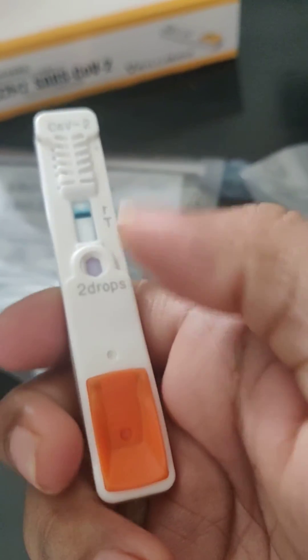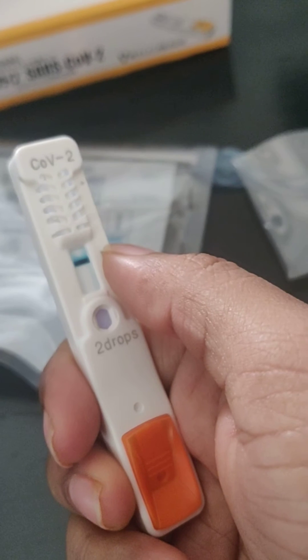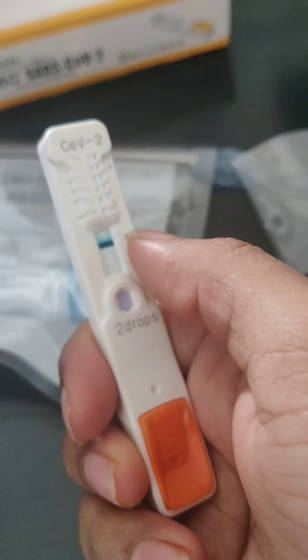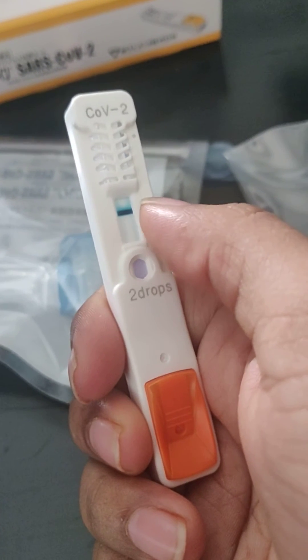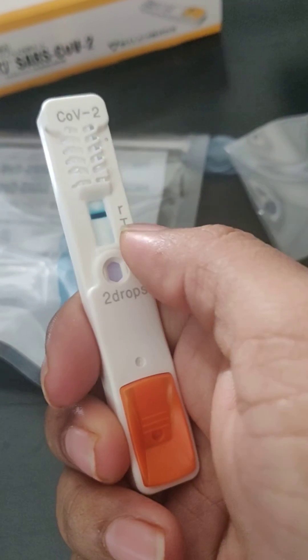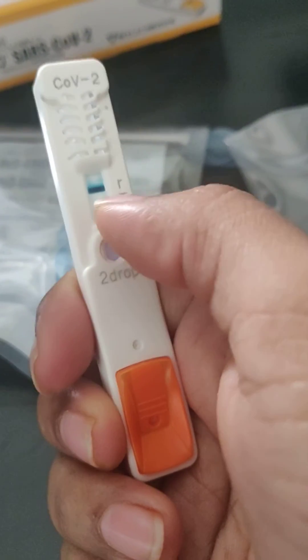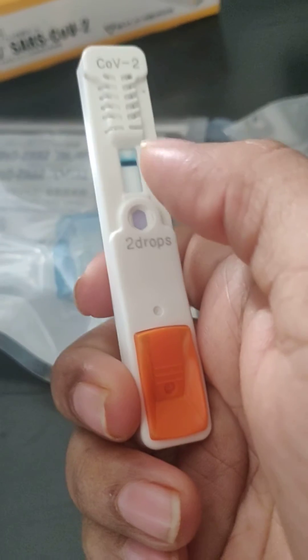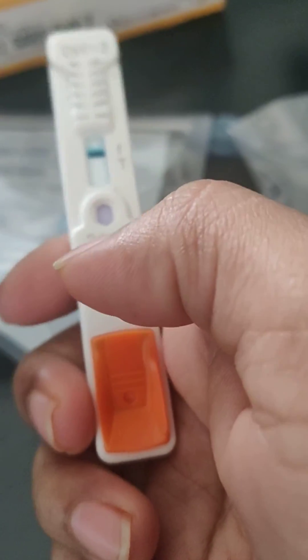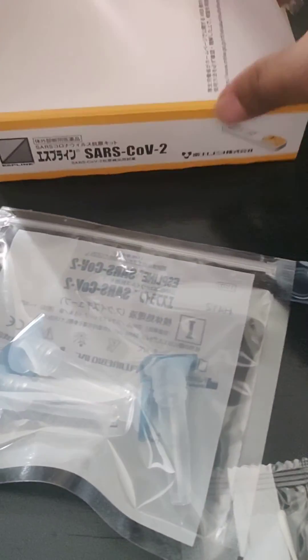Then immediately press this button — you have to do it immediately. Initially this color will be red, and after half an hour, if it turns blue, that means you don't have COVID. If you have two blue stripes beside the T, then you are COVID positive. If it's still red or completely white, there is some error in the testing and you have to repeat it.